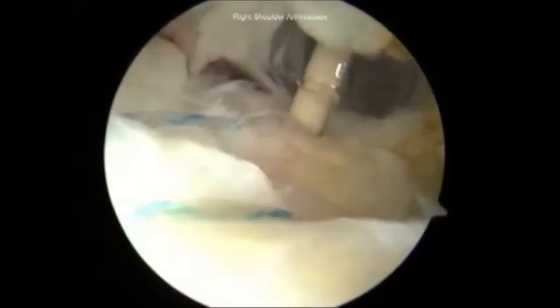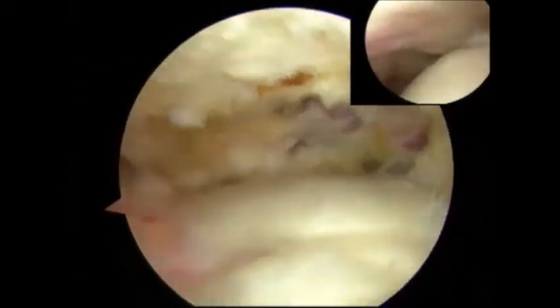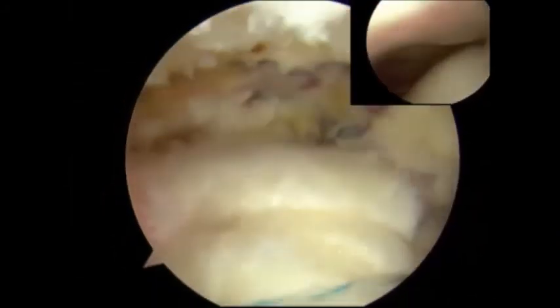After both sutures are tied down, two lateral knotless anchors are used to complete the double-row type of repair. The final repair can be seen with both cameras. Notice the near-anatomic intra-articular position of the repaired tendon. The final repair has also been tested.